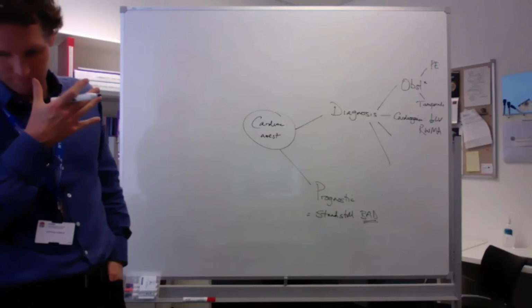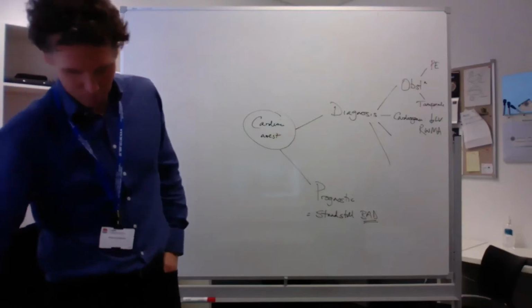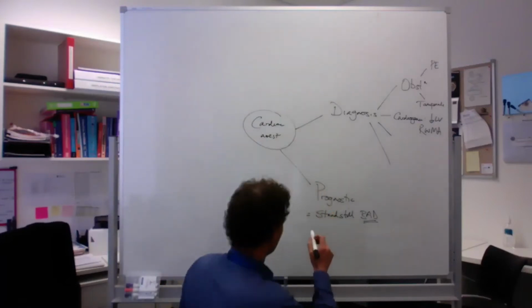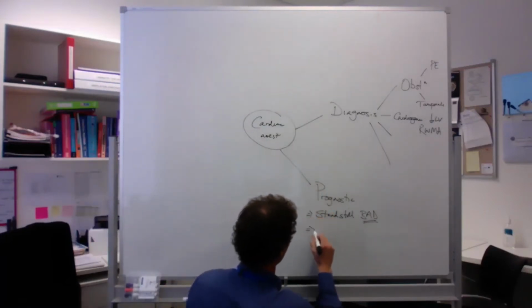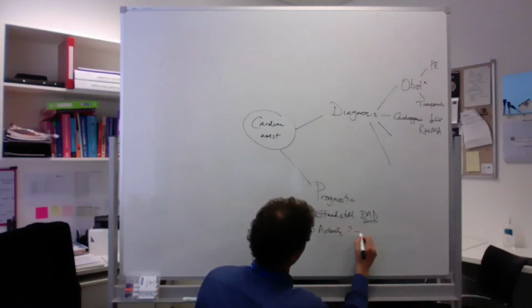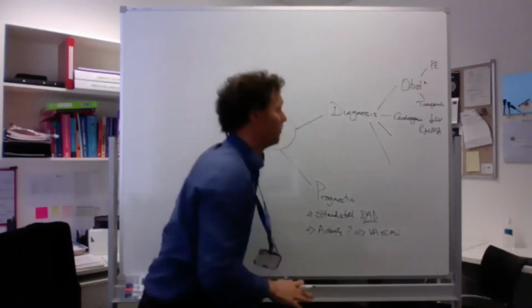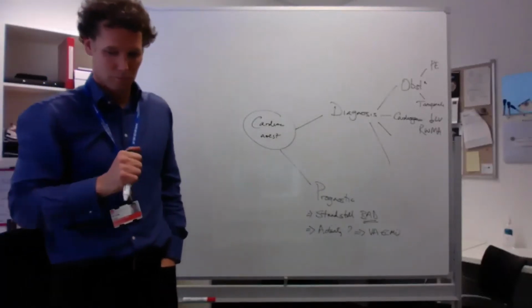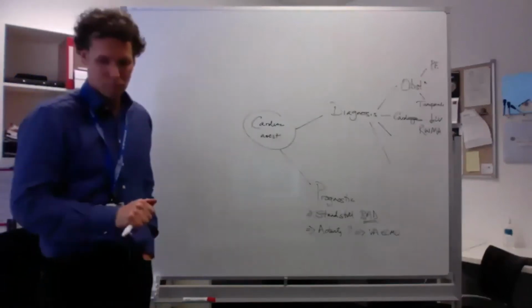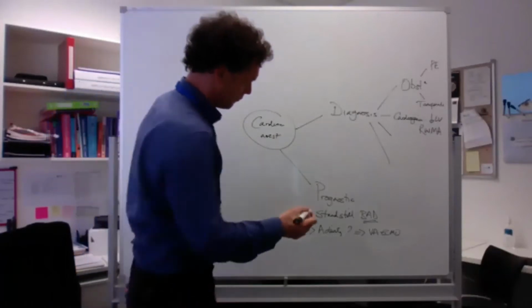Spontaneous ordered cardiac activity can be considered a sign of life to progress to higher level therapy such as ECMO in patients who would be appropriate. And then if you've got signs of chronic cardiac disease as an underlying comorbidity, that would give you some prognostic information as well.